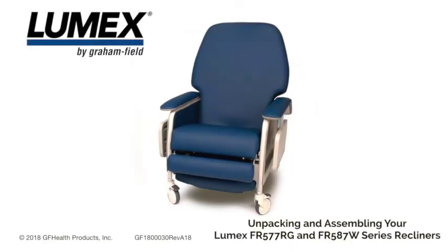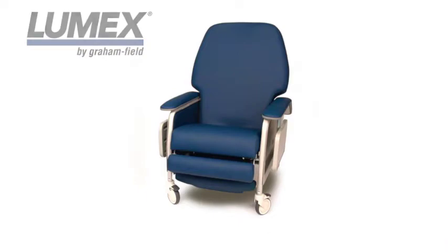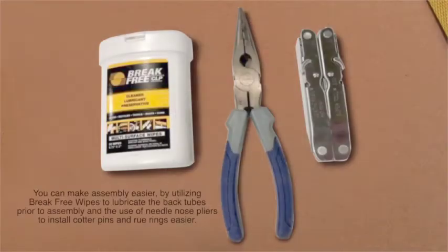To make the assembly of your Lumex recliner easier, we recommend you have the following tools available: a multi-tool and needle nose pliers.